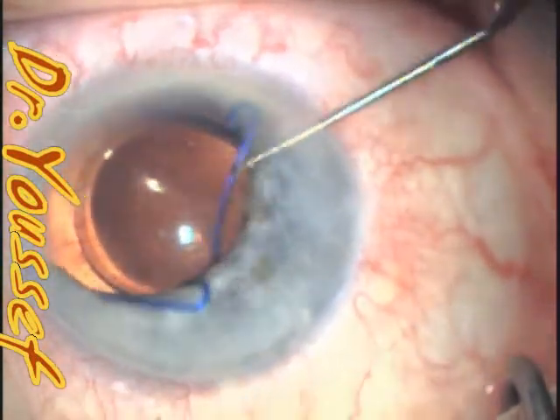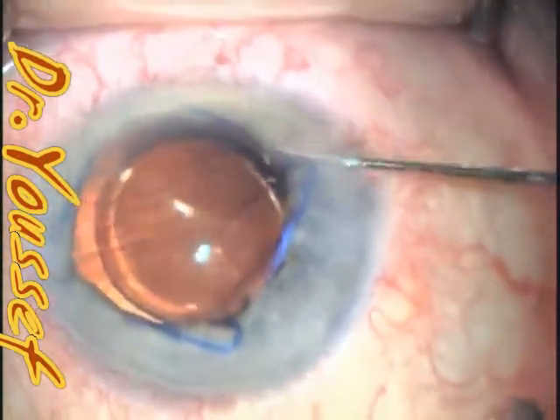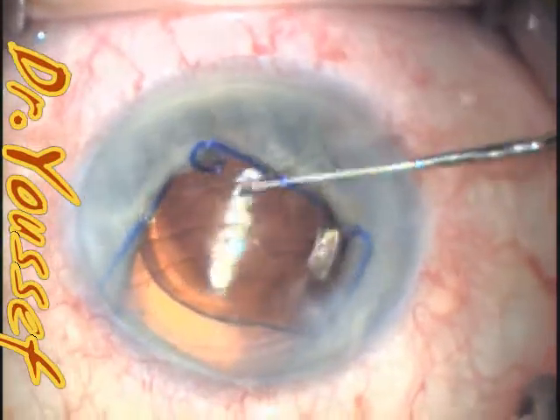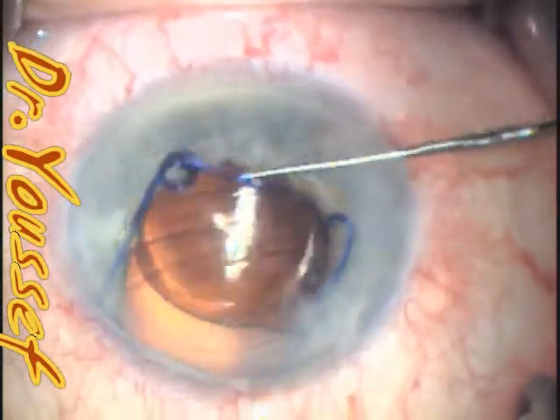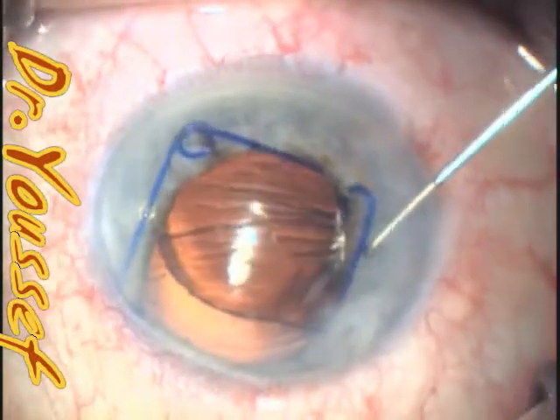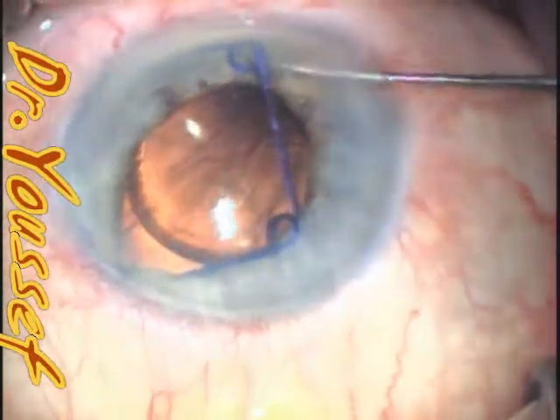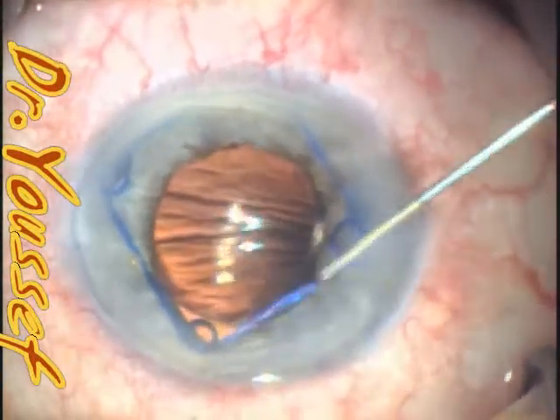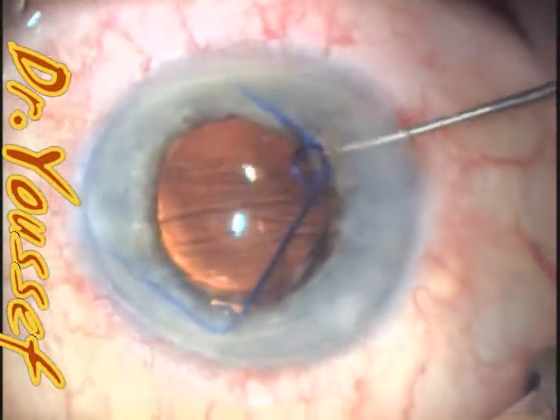To take it out after we implant the lens: I'll dislodge the upper one first, actually. And then the sub-incisional one. Then the inferior one will come at the wound, and that's what I would draw out first.